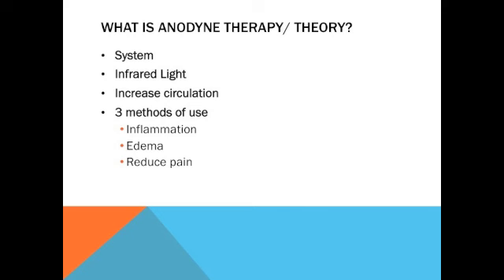It's a non-invasive device that has developed into a therapeutic procedure that is used in three main ways. These ways are to reduce inflammation, reduce edema, and reduce the pain associated with chronic joint disorders. Referenced by Chung, Day, Sharma, Hung, Carroll, and Hamblin in 2012.